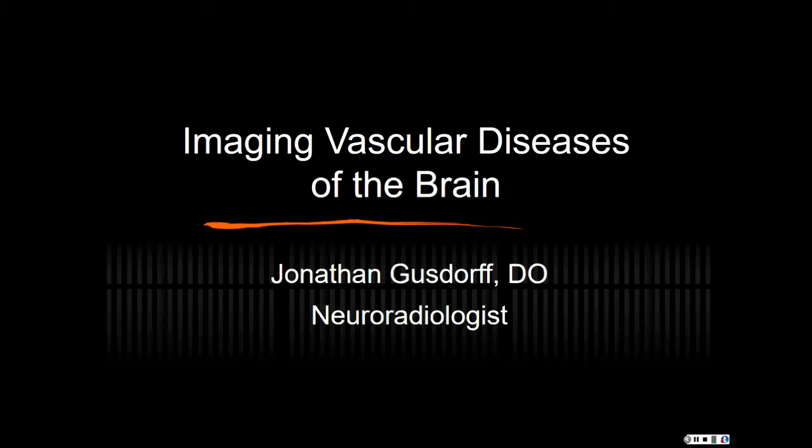And we just talked about the importance of reading diffusion-weighted imaging, DWI, alongside ADC maps to determine whether or not there is acute to early subacute ischemia. Is that 100% clear to 100% of you? Raise your hand if you want me to repeat it. There's no shame in not understanding. Okay. So when we do an MRI, we get a series of sequences all at once. T1, T2, flare, DWI, and ADC maps, along with gradient echo.